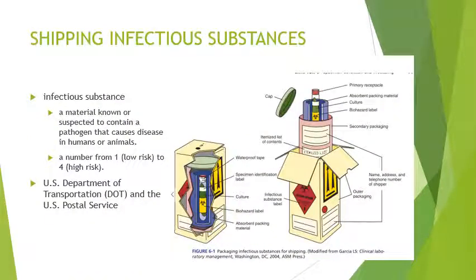Next. Sometimes we do not have the facility to do the blood culture or the bacterial culture, so we are shipping infectious substances. We do this when we are doing reference laboratory referrals. In the Philippines, the reference laboratory is your RITM. They are the only ones where infectious materials are sent.